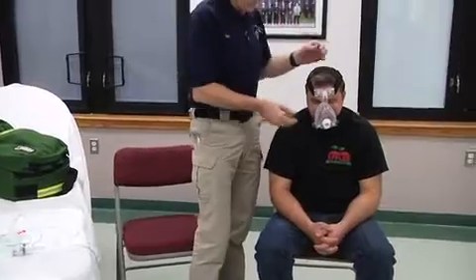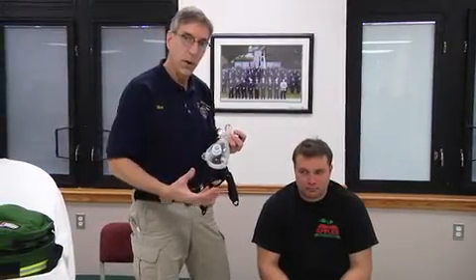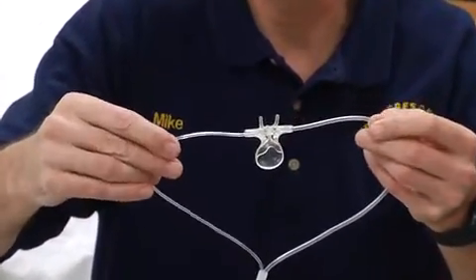Now let's talk about monitoring the individual. With the CPAP mask on the patient, I want to measure end-tidal carbon dioxide. Keep in mind that the flow from this mask — using a Venturi device — is actually around 160 liters per minute, which pulls in atmospheric air and doesn't deliver 100% oxygen concentration. In fact, we're probably only getting about 30% oxygen concentration. Someone in significant respiratory distress might need more oxygen, so your option is to put a nasal cannula on the patient in addition to what's coming through the CPAP.